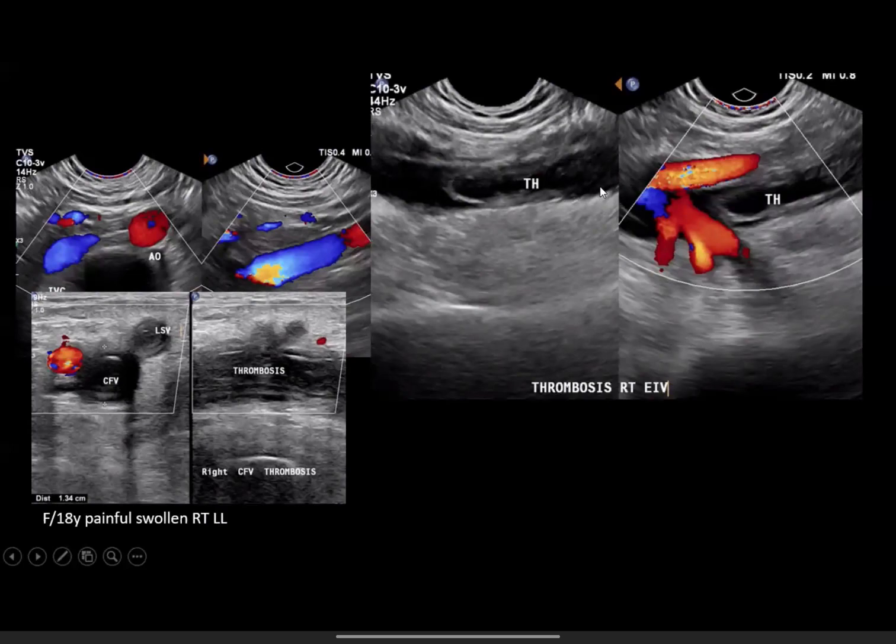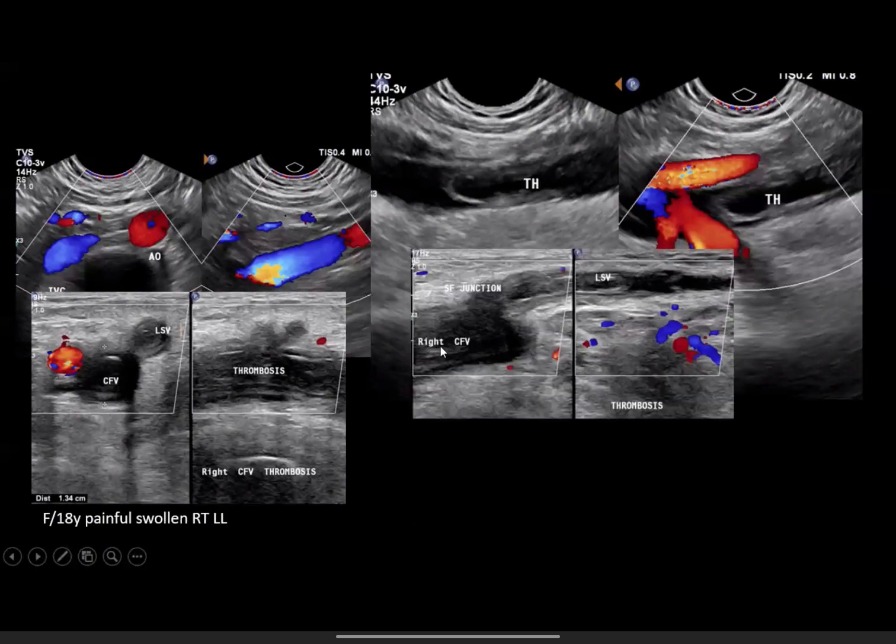The thrombus is extending into the external iliac vein with the proximal limit. This is the thrombic case, proximal edge. It is very dangerous. This can dislodge and cause pulmonary embolism. So this is the ideal case for IVC filter placement. So this is how we see the proximal extent of the thrombus.